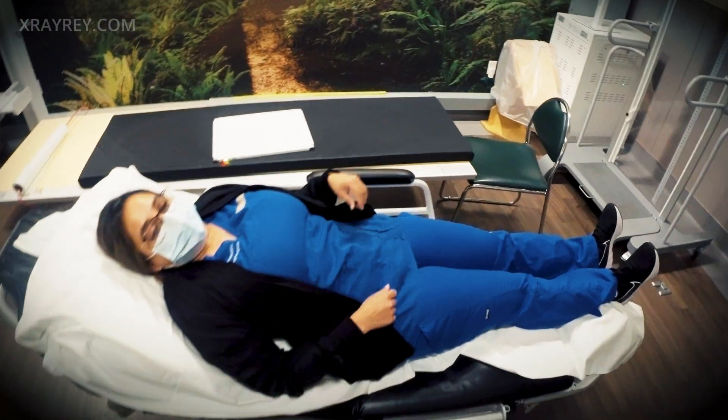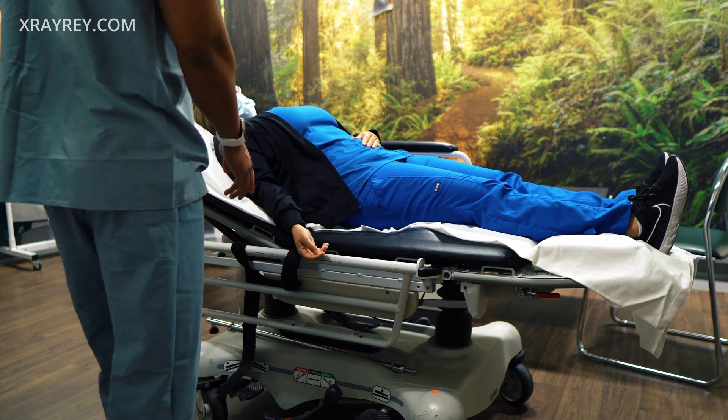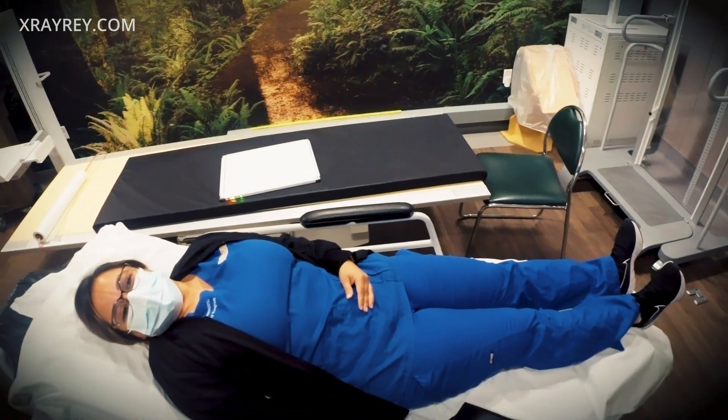All right, hello, my name is Ray. Looks like — did you fall? Yes? Okay, what is it, your wrist? That's certain, yes. Okay, all right, well we're gonna take a look at it and see what's wrong.